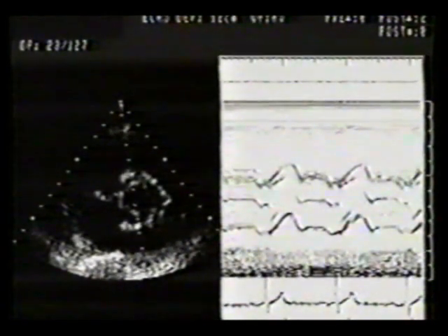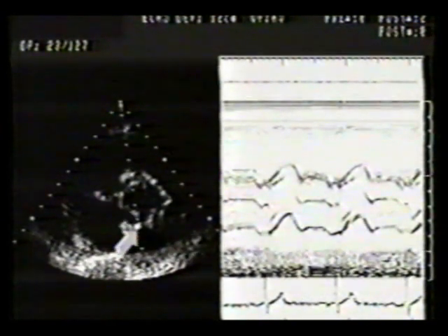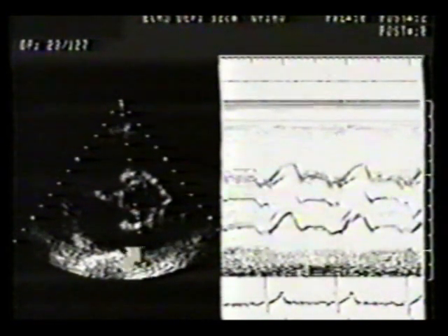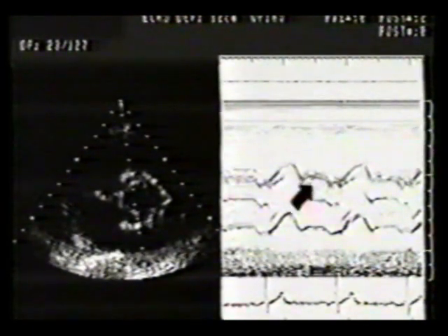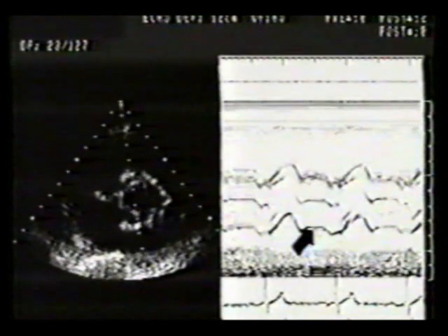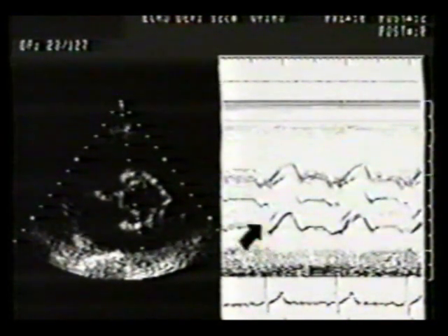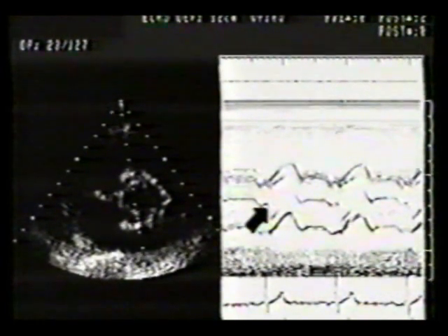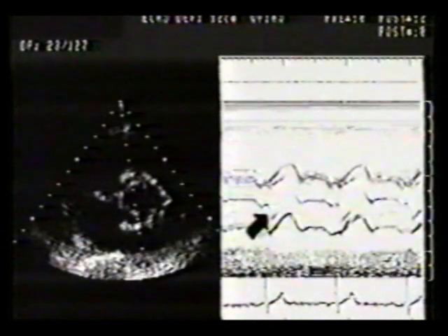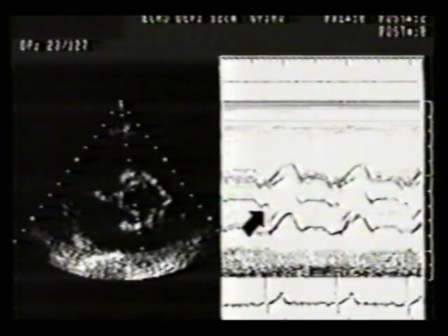The M-mode cursor has now been guided through the aorta at valve level and then through the left atrium. This is the right ventricular outflow tract, and these parallel lines are the walls of the aorta. This is the left atrium. Aortic valve motion can be identified within the walls of the aorta. With normal, thin aortic cusps, it is often difficult to record valve motion throughout systole.